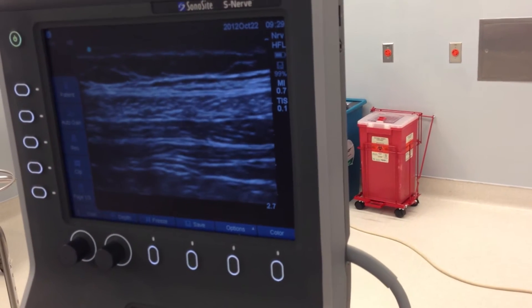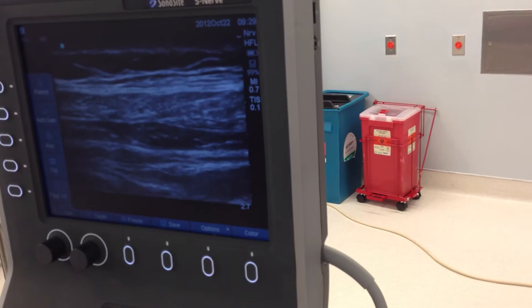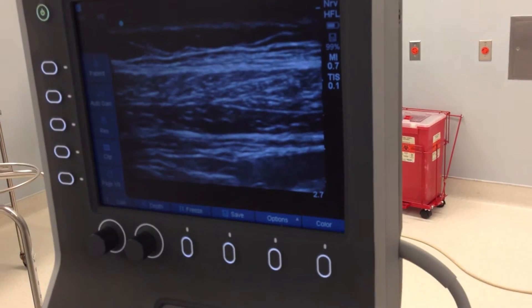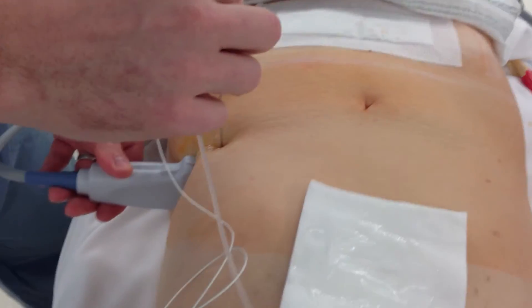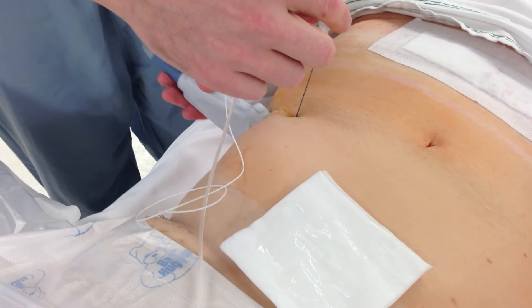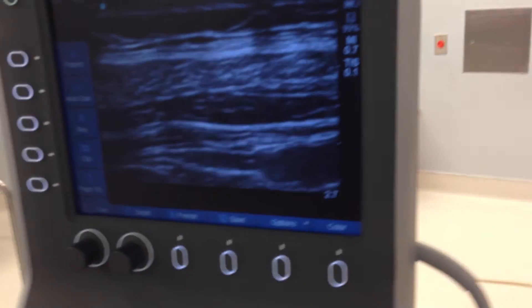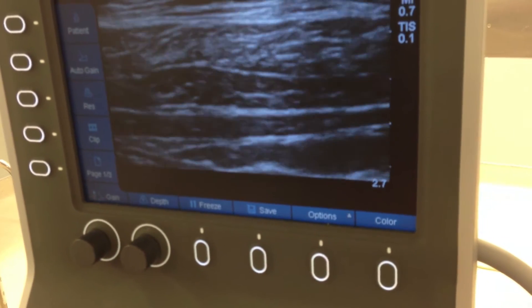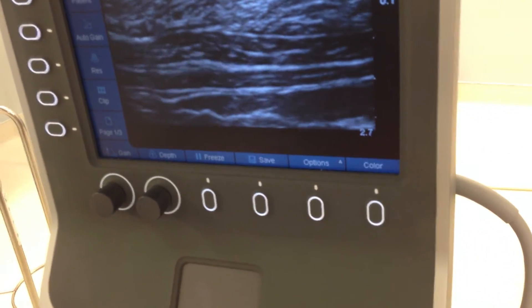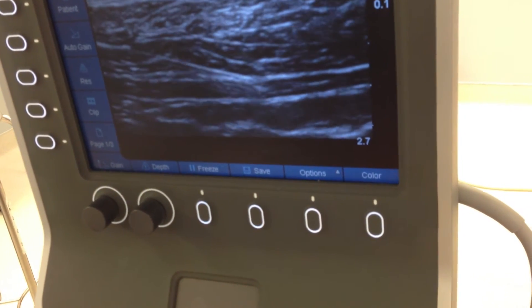So we'll put a little bit of this down here. She's actually breathing a little bit. Will you take a picture just of this real quick so people can see? I'm going from this fashion with a probe linearly and in-plane. What you'll see is I penetrate — there's my needle — right in the space that I'm trying to hit. Just popping through. It makes the needle very clear.